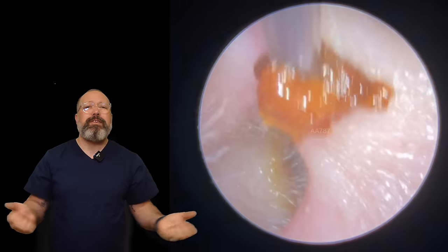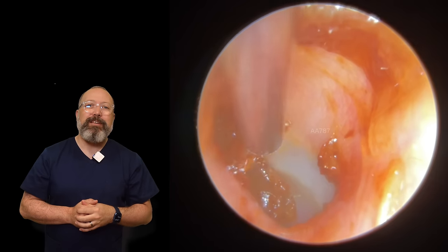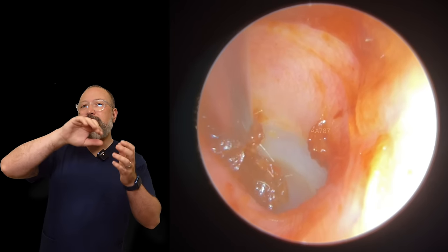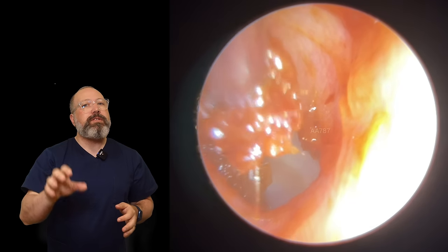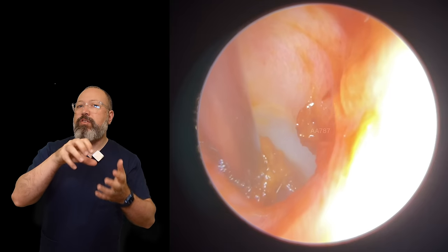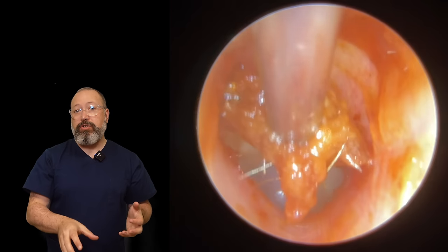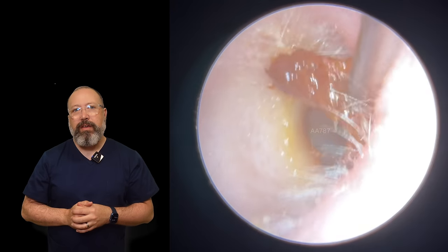It's peeling really nicely off the eardrum — that's what you want to see with this type of wax. There's a little bit more tucked around the anterior recess, which is where it gets really difficult. With softer wax tucked in there it's not always easy — if there's structure to the wax you can hold on and pull; with soft wax you're just taking surface layers off. Luckily a lot of this is jumping up toward the suction tube and we can see the eardrum beyond looking nice and healthy.